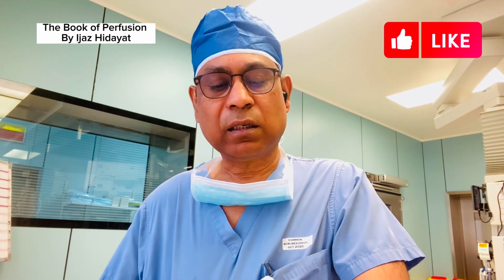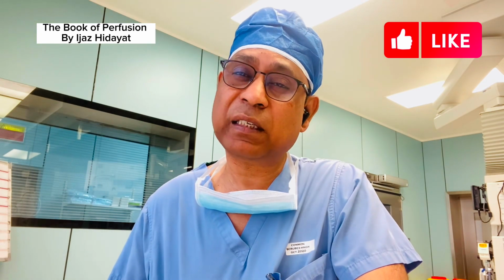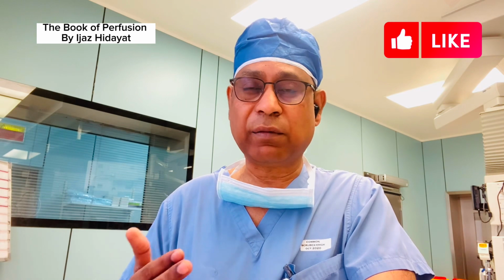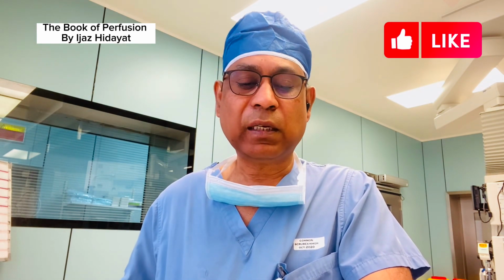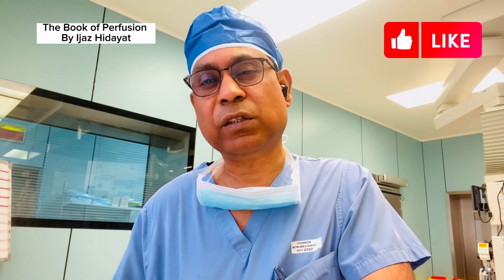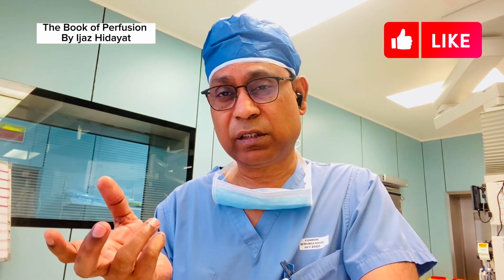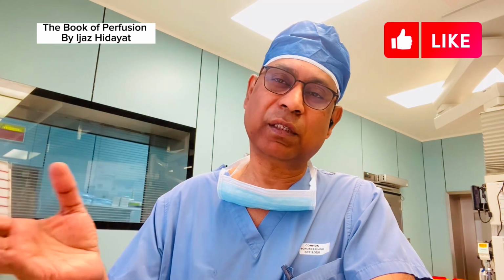We check the cerebral saturation throughout the surgery. It should be more than 50. In case your saturation is decreasing, we always try to keep full flow support to the patient. You will get some venous drainage issues during the surgery, but always communicate with the surgeon, and it is going to be resolved with the best communication between the surgeon and the perfusionist.